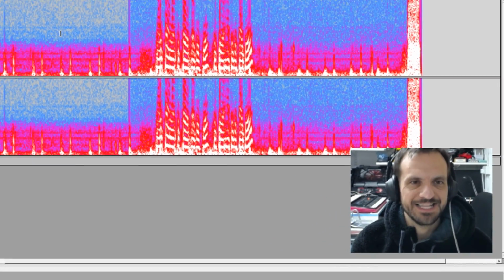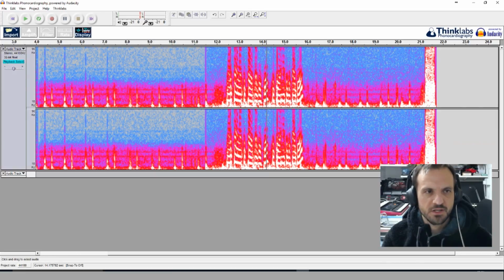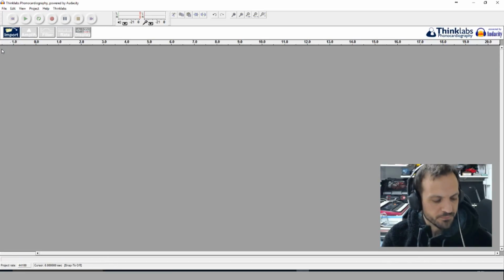And digital ones obviously have to do a lot of noise rejection. I can see that now. You know, when I play with this, it's really quite difficult. And I could give you an example, actually. I'm just going to shut this down. The microphone is just sitting on the desk, and I'm even going to sit it face down, which would be quite noisy. I'm just going to record for a moment to see what happens.